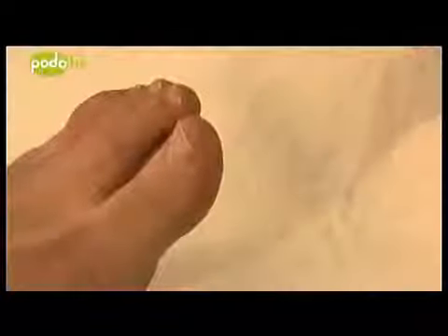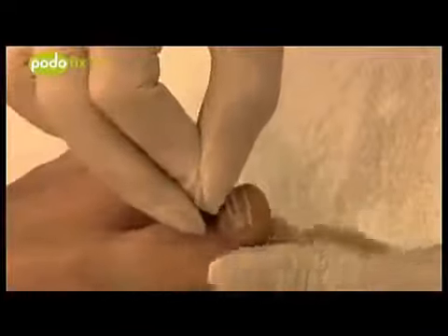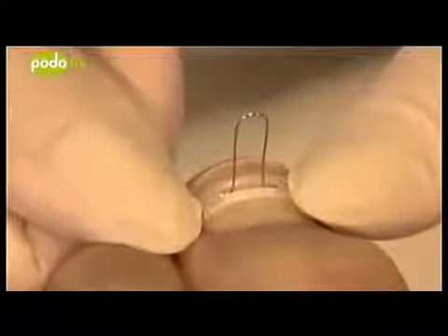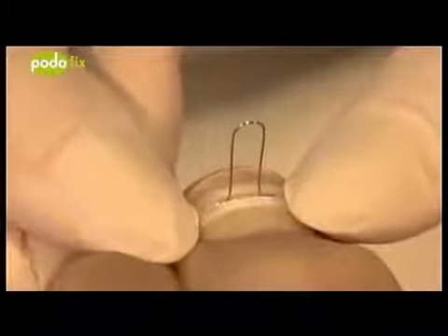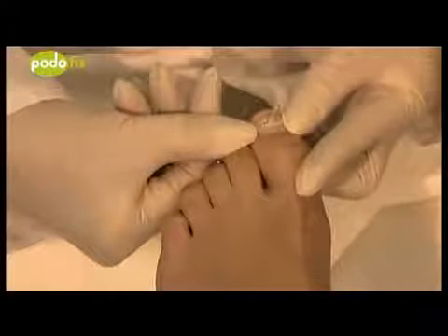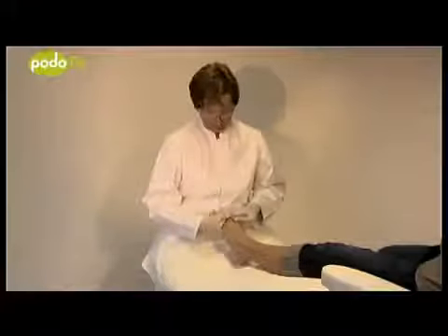The adhesive is now applied. Wipe the brush on both sides on the bottle edge and then moisten the entire brace underside with a thin layer of adhesive. Note that if too much adhesive is used, the brace will not adhere to the nail. Position the brace in the middle or on the side of the nail that is more strongly ingrown, and place it carefully on the nail. Press down with your fingers for about 15 seconds and press down the brace at its edges as far as possible toward the nail creases, so that the central part of the brace also lies on the nail — press primarily in the edge areas. Before activation, wait two minutes until the adhesive has hardened.